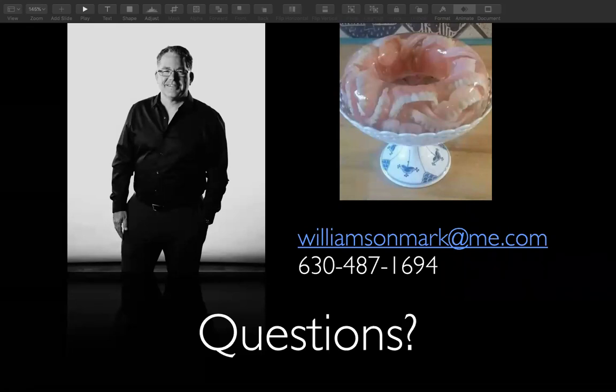So, I don't really say anything then, but if I talk to the restorative doctor later, I may say, hey, by cutting these down, we're going to have to look at our restorative space when you're ready to do the final, because typically you may have an issue with space, and we may not be able to do a typical all-on-4. Now it's going to be a more expensive prosthetic.